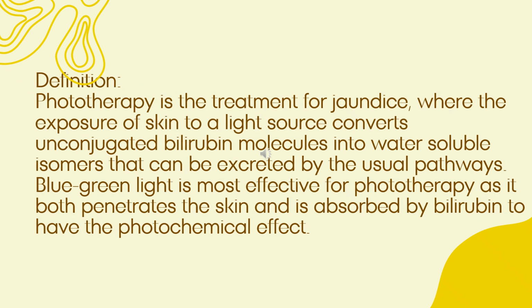Therapy. Photo means light, therapy means treatment. So phototherapy means treatment with light. According to the definition, phototherapy is the treatment for jaundice where the exposure of skin to a light source converts unconjugated bilirubin molecules into water-soluble isomers that can be excreted by the usual pathways.